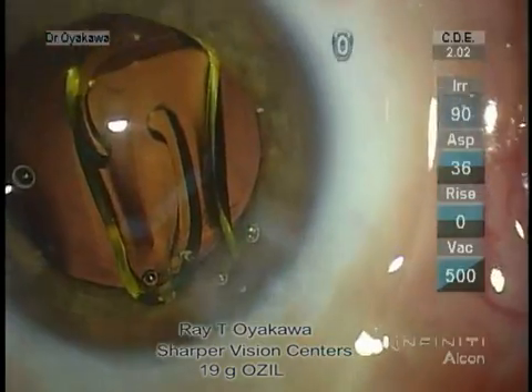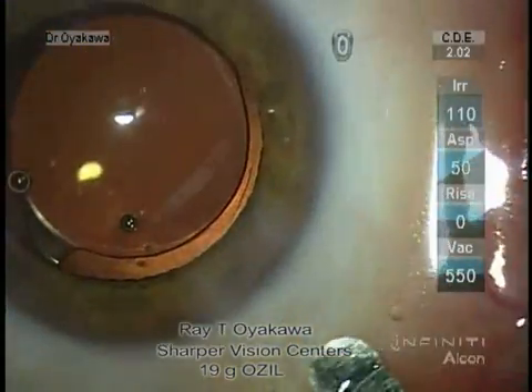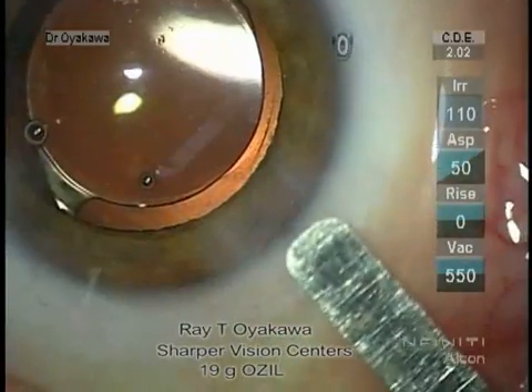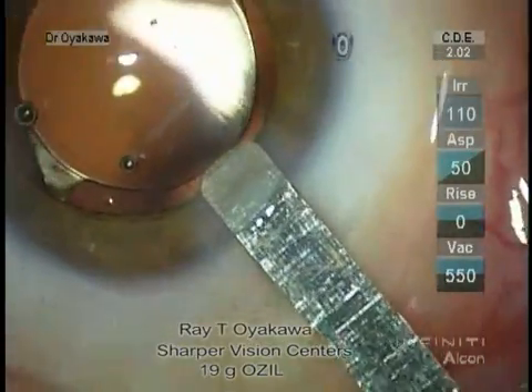The lens almost didn't go in right at the end. There wasn't sufficient counter-traction and the cartridge could pull away from the wound a little bit. The wound is about 2.1 after insertion.